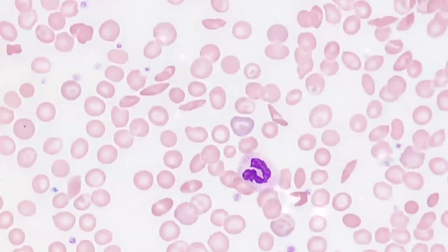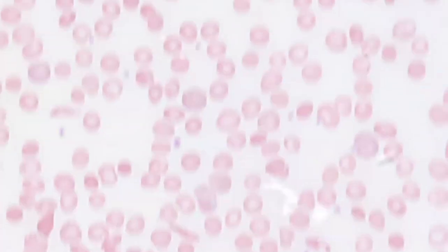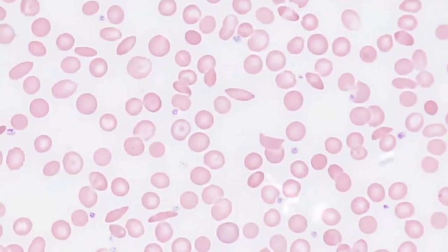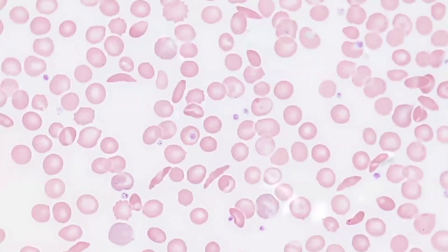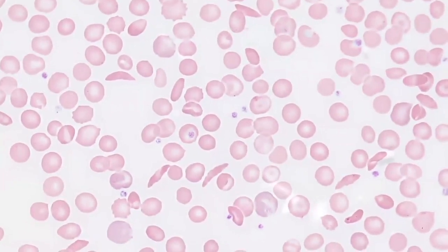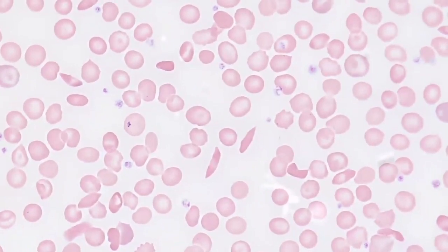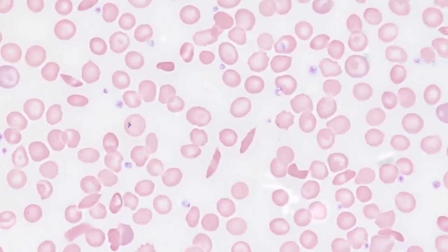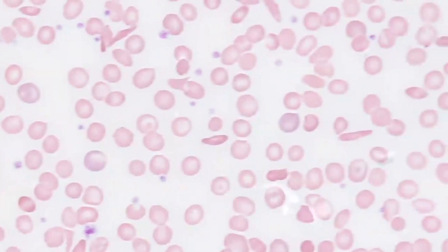anisopoikilocytosis. As we scan around, I want you to see all of the different sickle cell morphologies. As you could imagine, there are occasions where you could misinterpret these cells as elliptocytes. However, take this example as a prototype for what sickle cell or sickling disease looks like on peripheral smears.